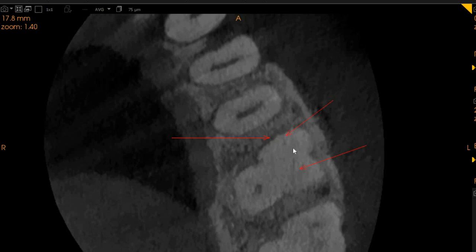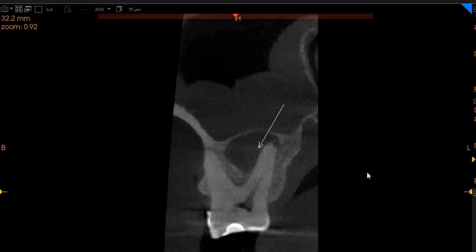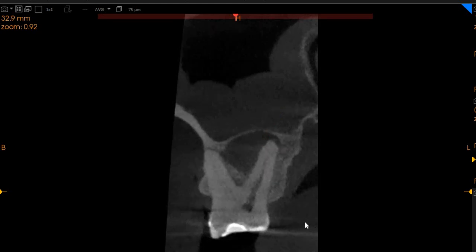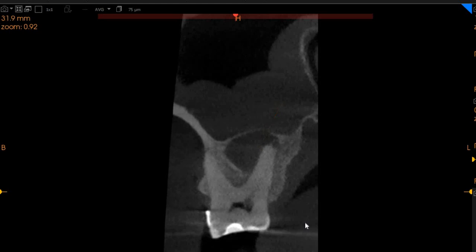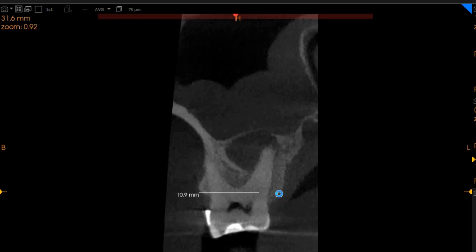We can also see that this is the palatal root, and there is a huge periapical radiolucency associated with the palatal root, which is very evident right here. This tooth has a very significant apical infection along with the crack line. The ridge width is 14 millimeters whereas the height in this region is 8.4 millimeters.